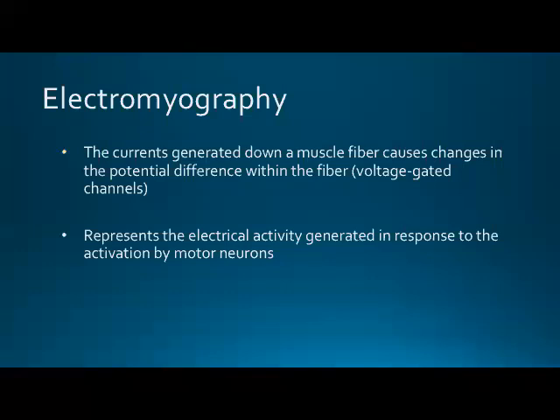Just on the other side of the innervation zone, you're going to get a positive change, so we'll be able to pick up some electrical potential. But the further away you go on that muscle fiber, away from the innervation zone, away from the source of that electrical change, the lower your EMG signal is going to be. So when we start placing these sensors, there are specific criteria and recommendations for sensor placement to avoid innervation zones and to ensure that we get the best possible estimate of that action potential or that change in electrical potential down the muscle fiber.